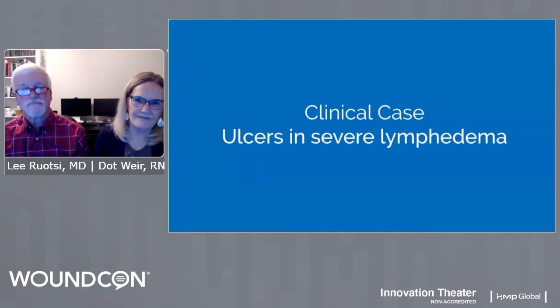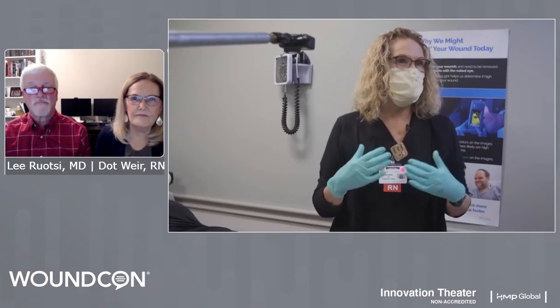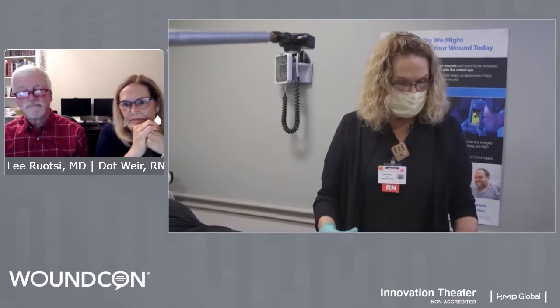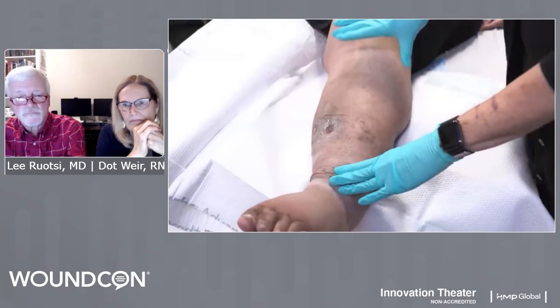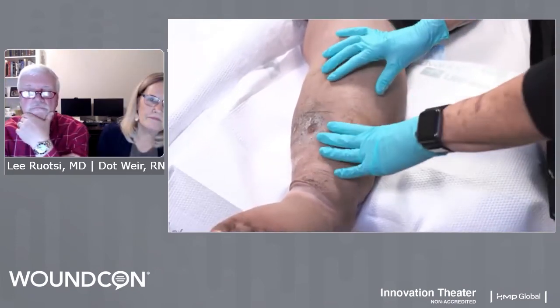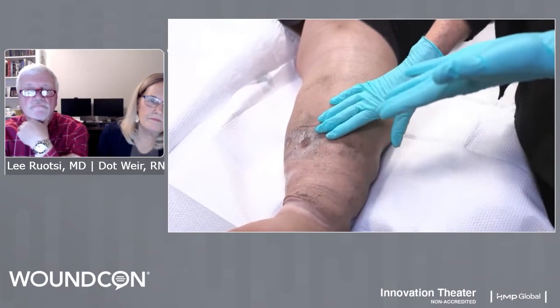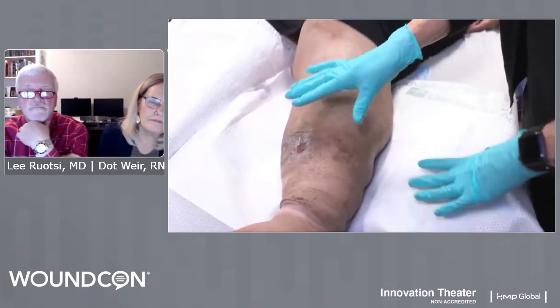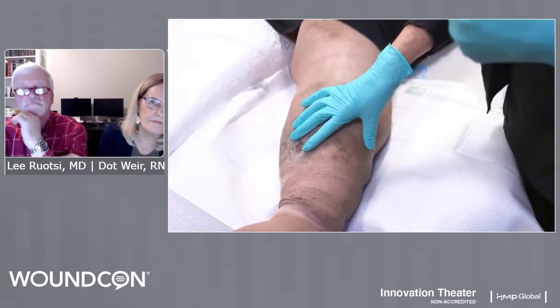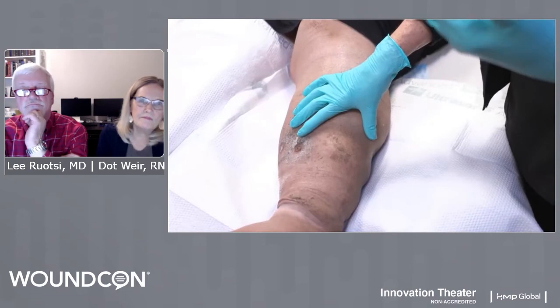This is a very special patient we've been taking care of for a long time. She has really significant lymphedema. We needed to get her left leg closed before she started treatment for her right leg. We've been using traditional short-stretch wraps, and we've had significant reduction — her calf is almost 15 centimeters smaller than when we started. It looks like such an innocuous wound, but when we do the imaging, what you can't see with your eyes will surely show up with the Moleculite.